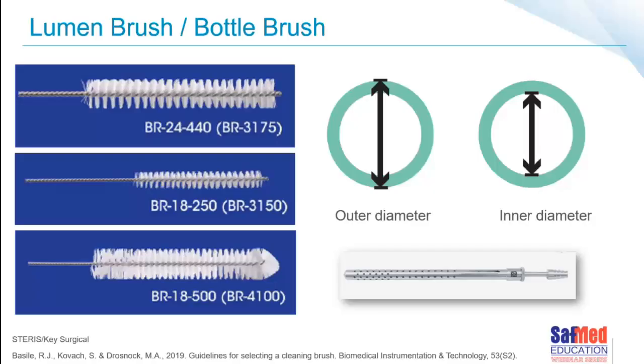I'm sure you all know the pool sucker. If we dismantle the pool sucker, the very tip of it is not completely open. There is, in fact, almost a little nipple or a little shelf that you have to clean as well. You can't get a brush all the way through that pool sucker. There's a little section of metal at the bottom over there that we also need to take into account.